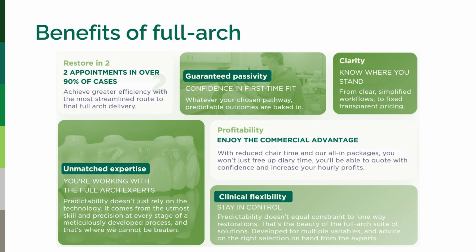As I've explained in an earlier slide, the CAD and the CAM are critical, and how that information and data is dealt with, that is not something that every lab is going to be able to deal with at the same level. So understanding that there is expertise required there, and that just the data is not the end of the story. There are clear profitability aspects for you in practice.